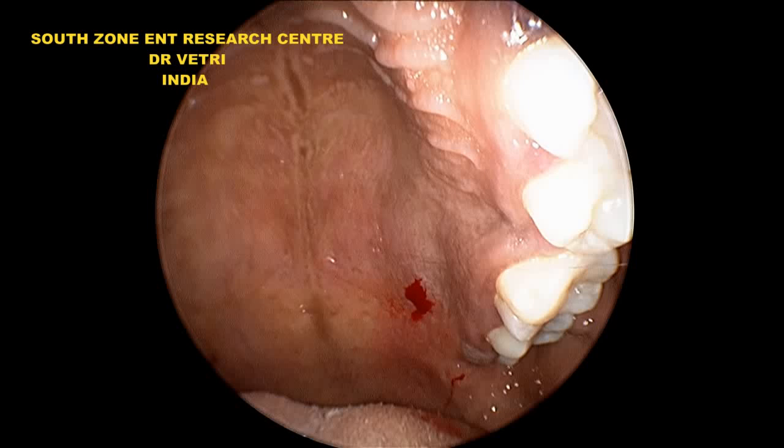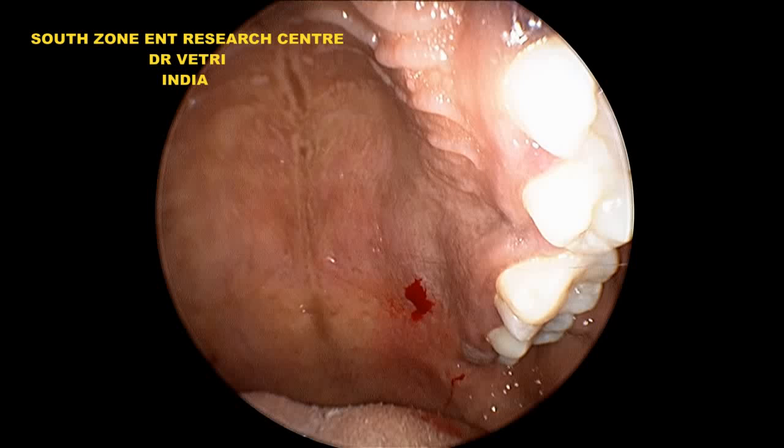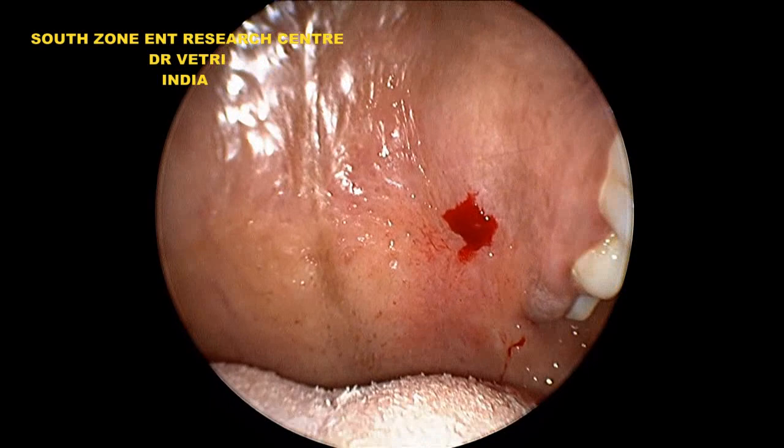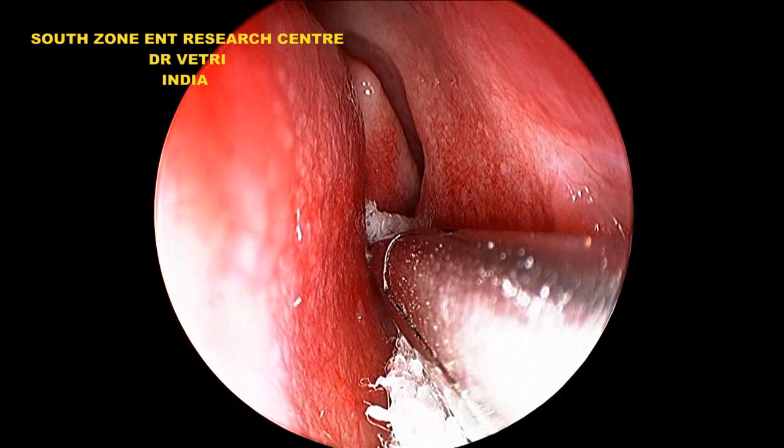Now you can see the site of infiltration. We plan for anterior turbinoplasty under local anesthesia, and now the patient is ready for surgery under local anesthesia.